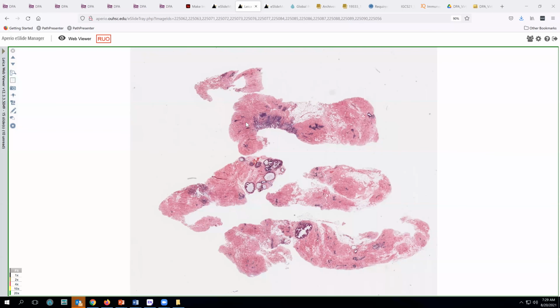So in our world, where I am practicing, typically the patients will have screening mammograms plus or minus ultrasound examination. And most of our samples are ultrasound guided biopsies if they've detected an abnormality. The radiologist, who is often the one doing these biopsies, will report what they call the BI-RADS score.